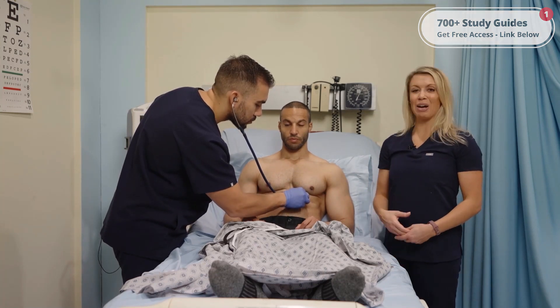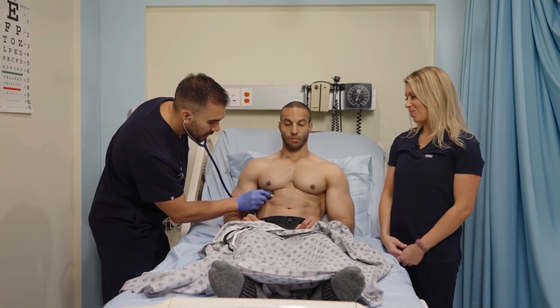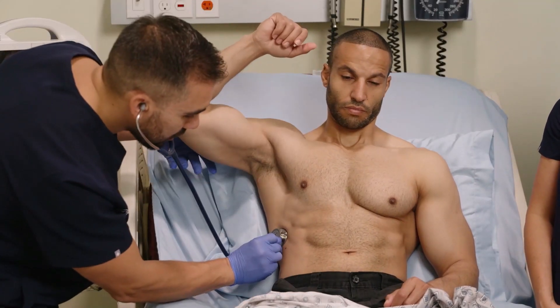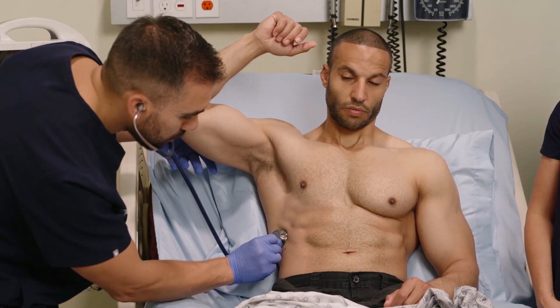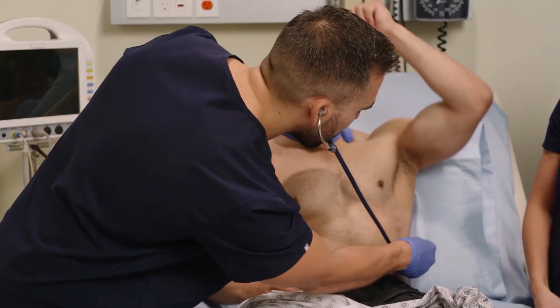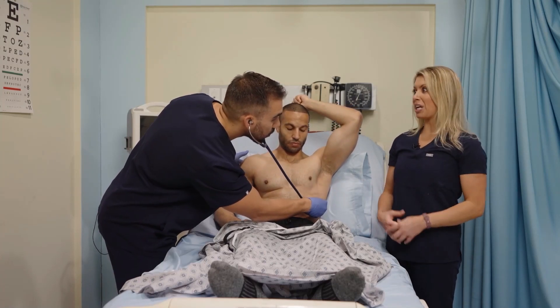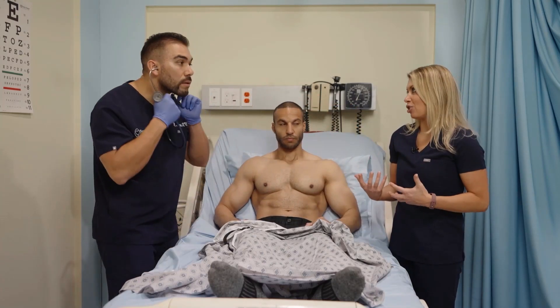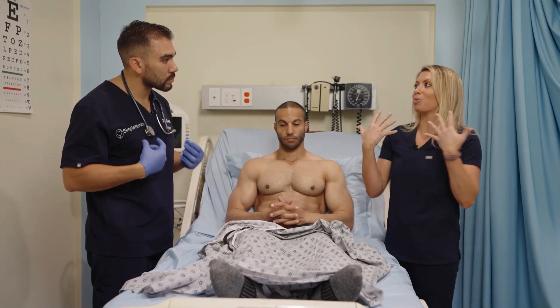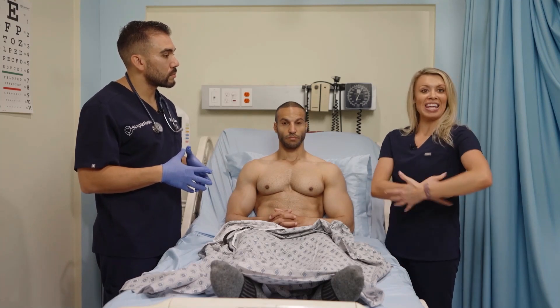That shows us the patient is getting good gas exchange. When you assess the side, you want that arm lifted up. The side is a great location at the mid-axillary point on the patient because you can hear a few lobes at once. It's especially useful if you can't access the patient's back — for example, if you're worried about a cervical spine injury and don't want to rotate them side-to-side just yet.